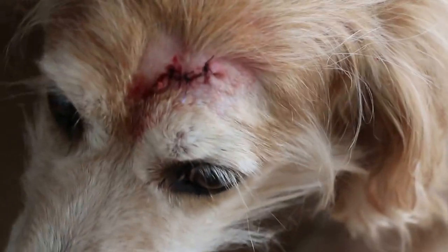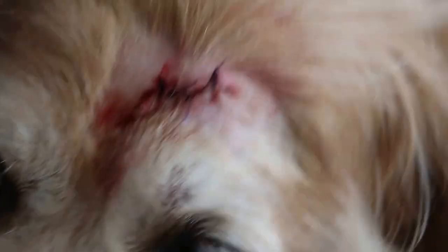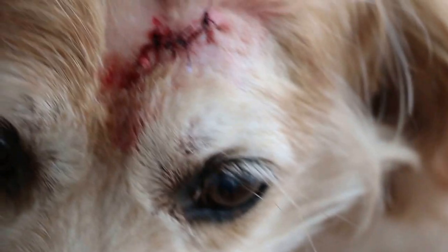So, electrosurgery — electricity to cut the wart. And where's the wart now? I did take a picture just now. So about 14 days it will recover. The bigger piece of skin is removed so that the wart doesn't regrow.